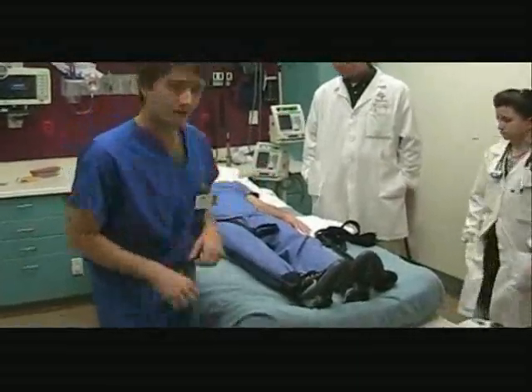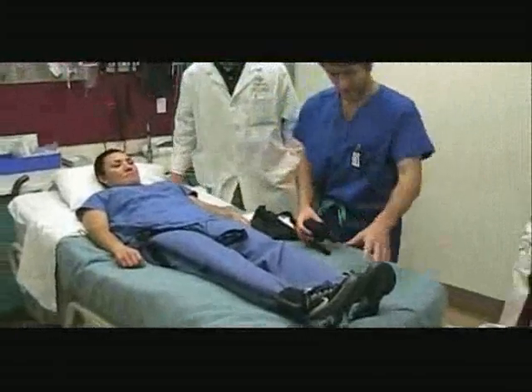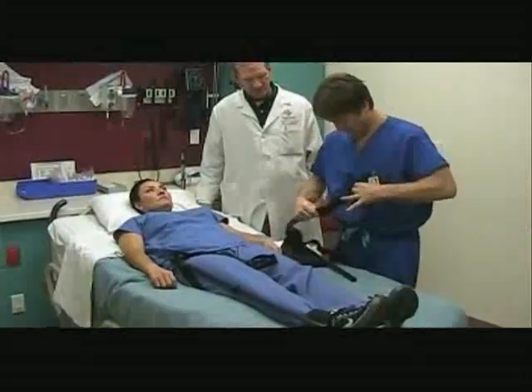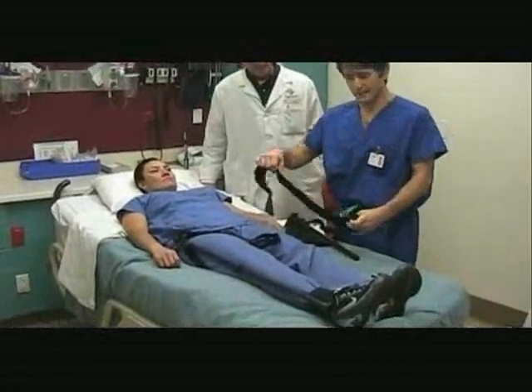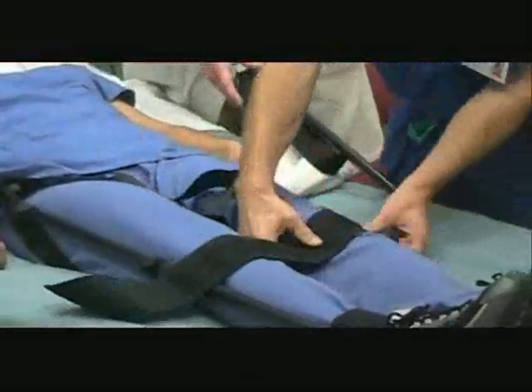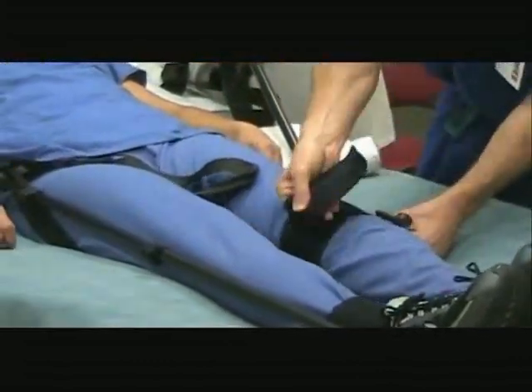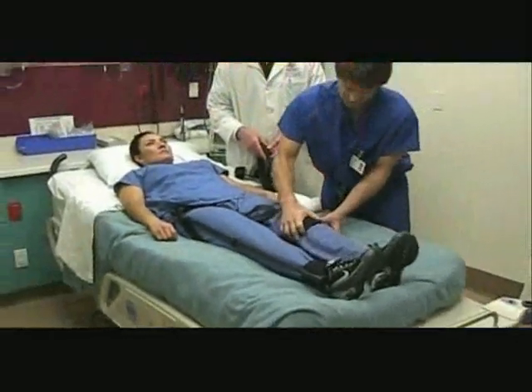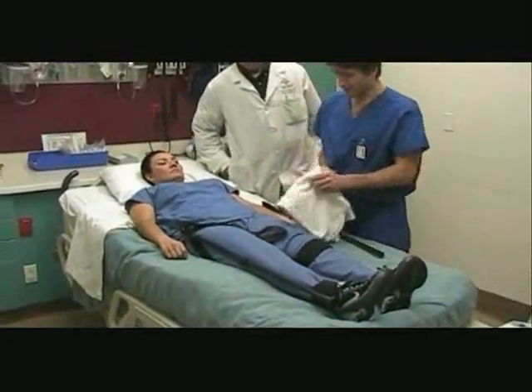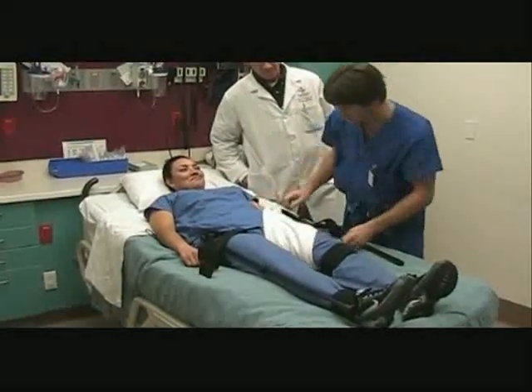I'll demonstrate again on the other leg with a different approach. Suppose that you've stepped on a land mine and you don't have a lower leg anymore. This can be applied just proximal to the calf. It has to be applied fairly snug because you don't want it to slip down. I put this towel here because you can apply this inside the thigh — it keeps the straps clean and may add a little comfort.